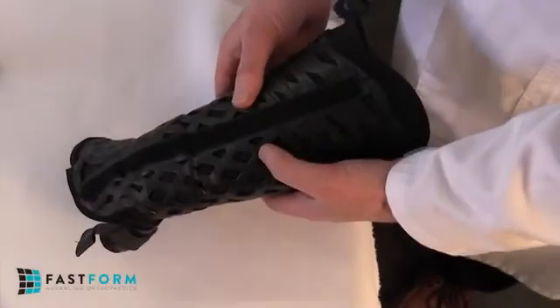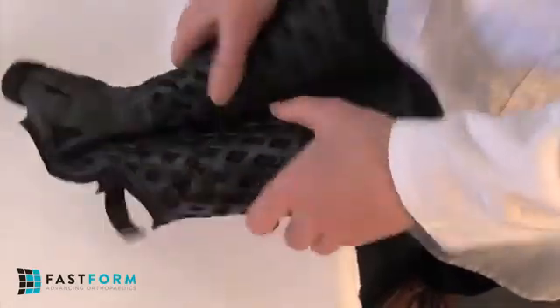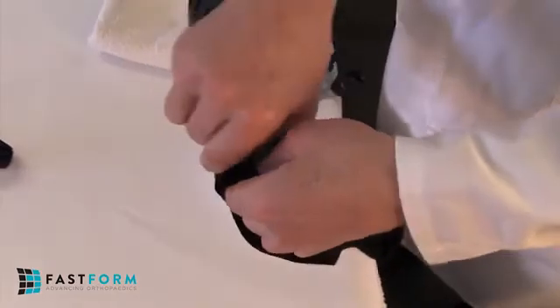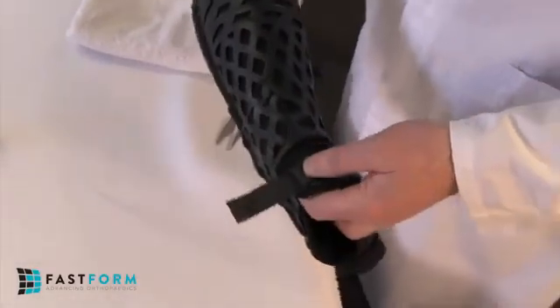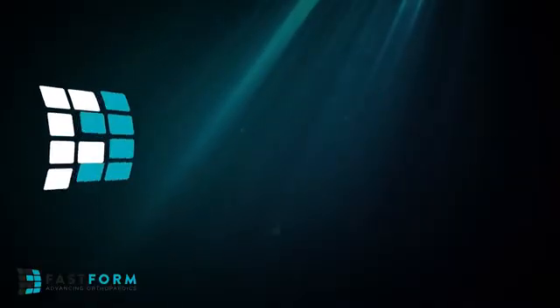Once the thumb spica has been removed, it can be used as a rehabilitation brace to provide continued support to the limb. To prepare, completely flex the overlapping wings back and forth to loosen the hinge until it flexes easily. Repeat for the palmar cuff hinge. The thumb spica closes and opens easily and is now ready for rehab use.